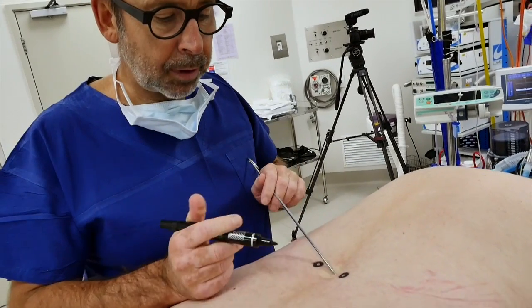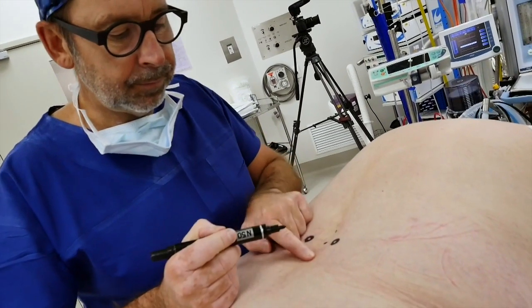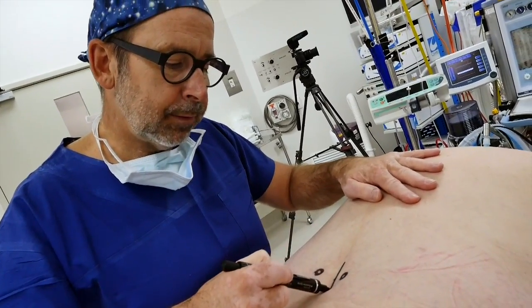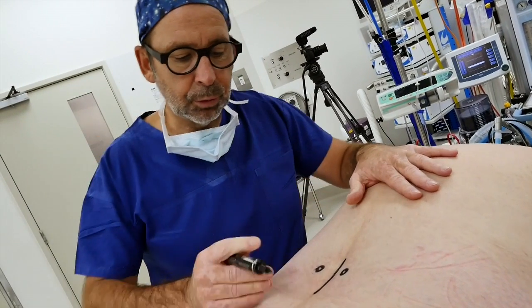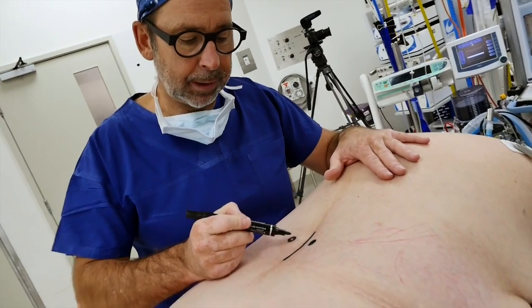I can palpate the spinous process here and here. I want my incision to be about one third above and two thirds below, so I can already draw on this lady exactly where I want that to be before we've prepped.